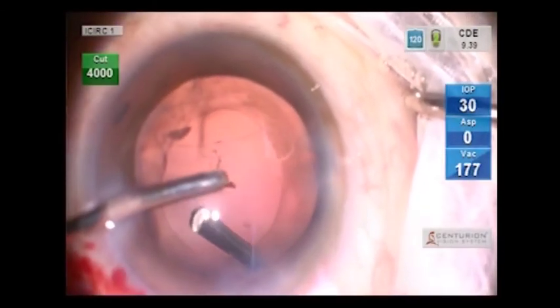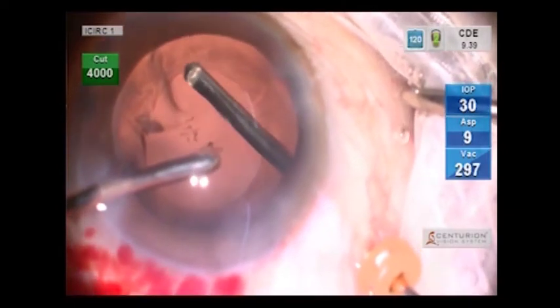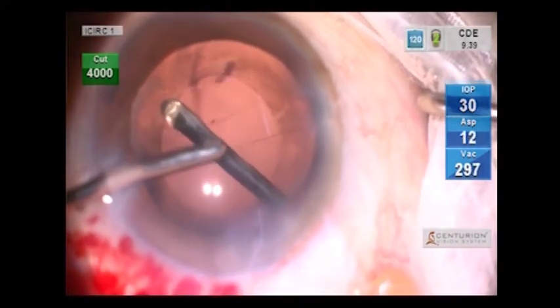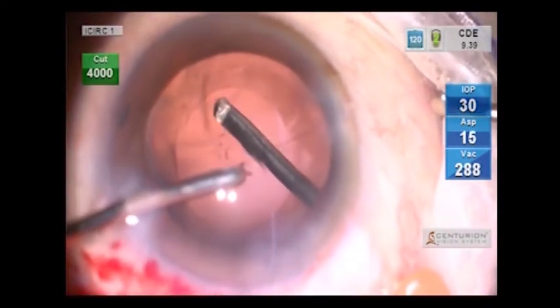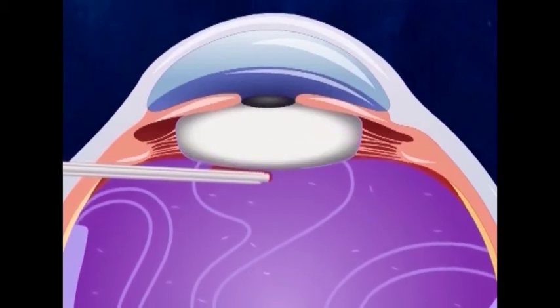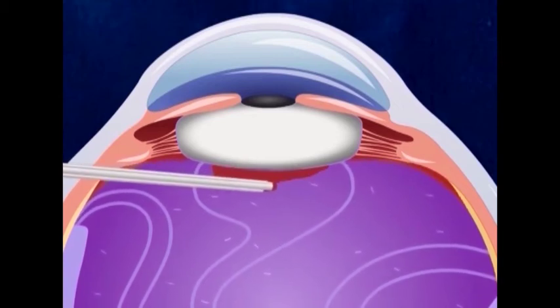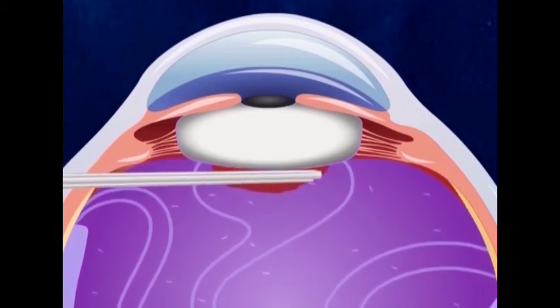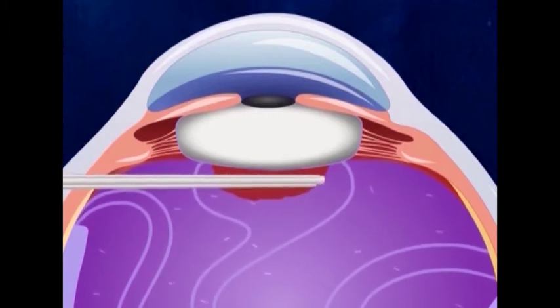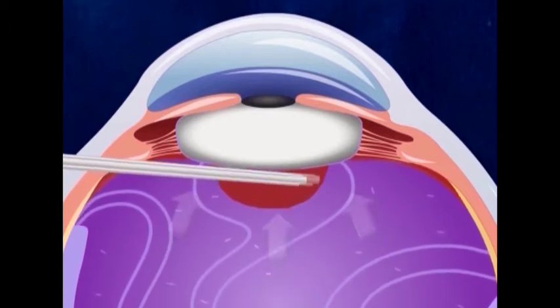If we wish to restore this symmetry, it is important to remove vitreous all around the capsular bag. This is best achieved by the pars plana approach. When introduced through the pars plana, the vitrector can easily remove adequate amount of anterior vitreous symmetrically behind the IOL capsular bag complex. The result? A symmetric scaffold for the IOL.